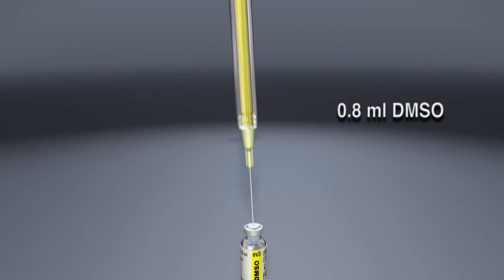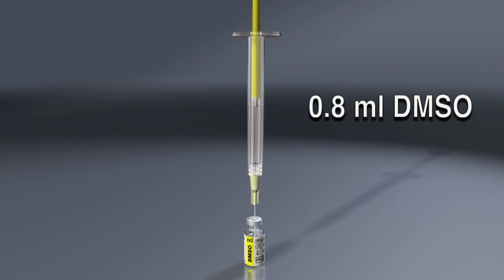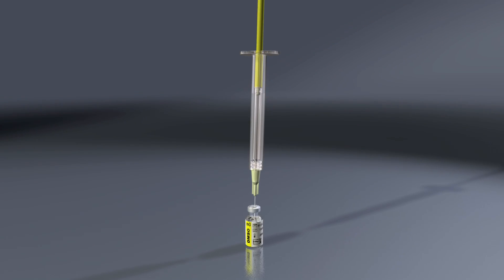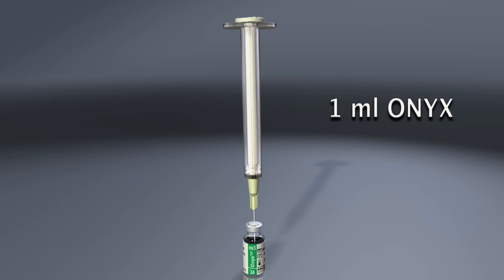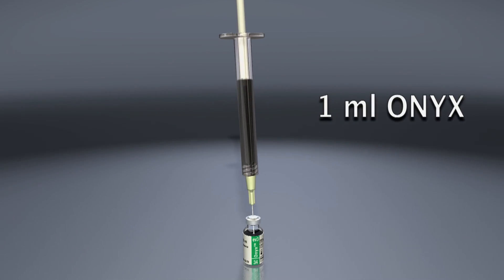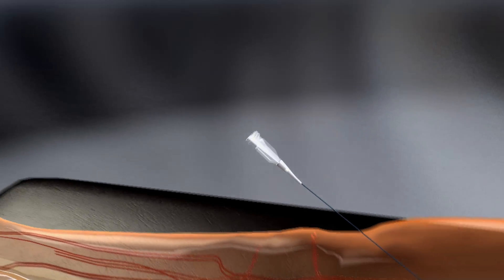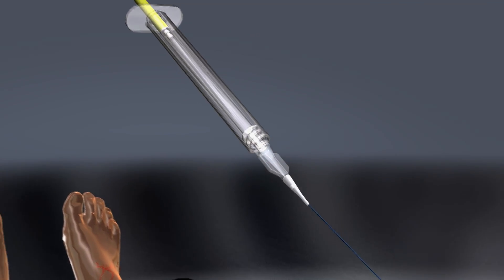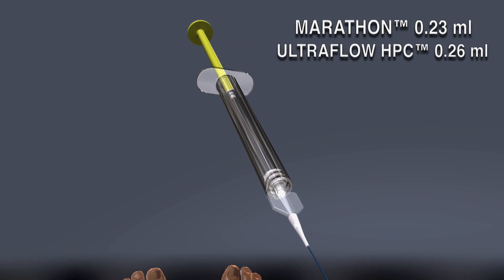Aspirate approximately 0.8 milliliters of the supplied DMSO into the yellow 1-milliliter DMSO syringe. Next, aspirate exactly 1 milliliter of the mixed Onyx into the white 1-milliliter Onyx syringe using an 18 or 20 gauge needle. Connect the yellow DMSO syringe to the delivery catheter and inject the DMSO in sufficient volume to fill the catheter dead space.